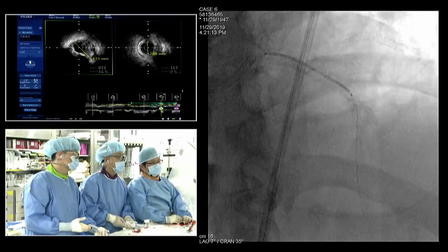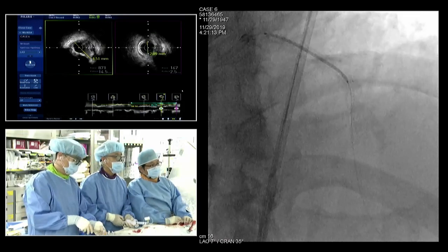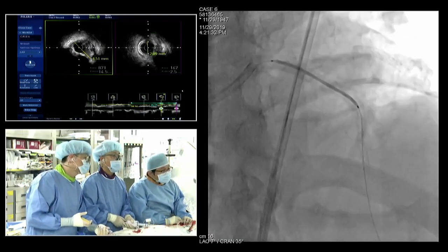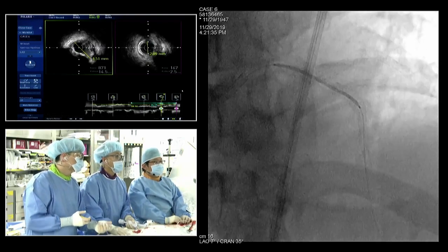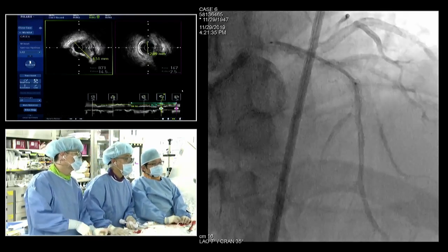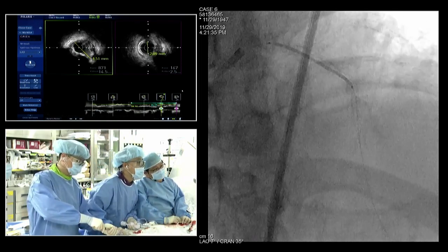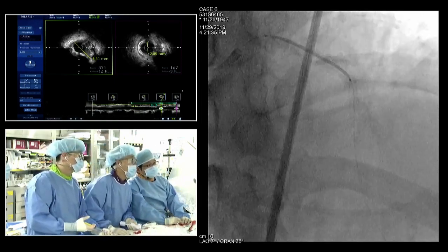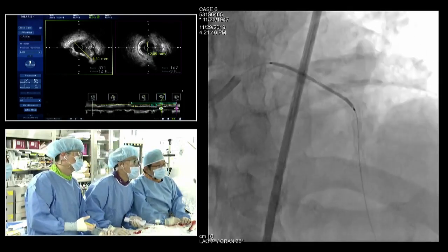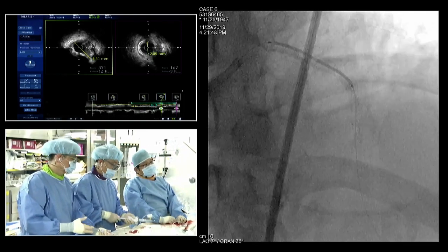Diameter, did it go in fully or not fully? 3.0. This is 30. We're gonna stent boost. Test. A little bit short, but I don't care. Place the boost another one. Okay, it's fine. 38. Okay. Inflate 10. 10.